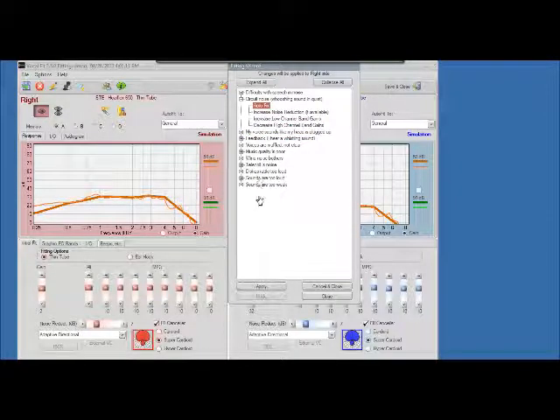Now if we do auto fix here, every time I click it, you will see that the noise reduction raises. Okay, I may get to a point where the patient is still hearing that whooshing noise in quiet or an air sound in the background, but it may start to cut out other noises. They may say, well, that's gone too far because now I'm cutting out a lot of stuff. Okay, so we want to undo a couple steps.